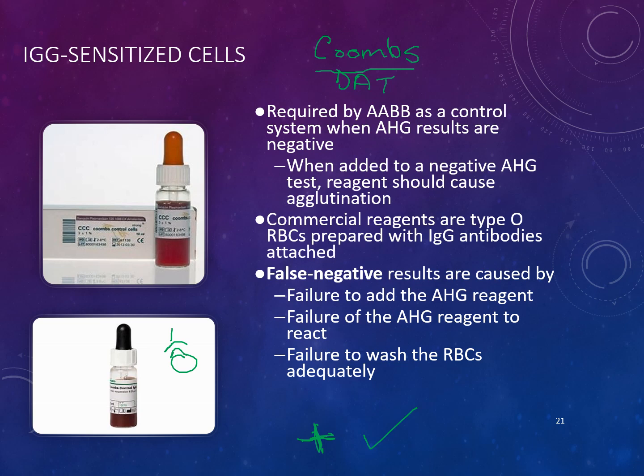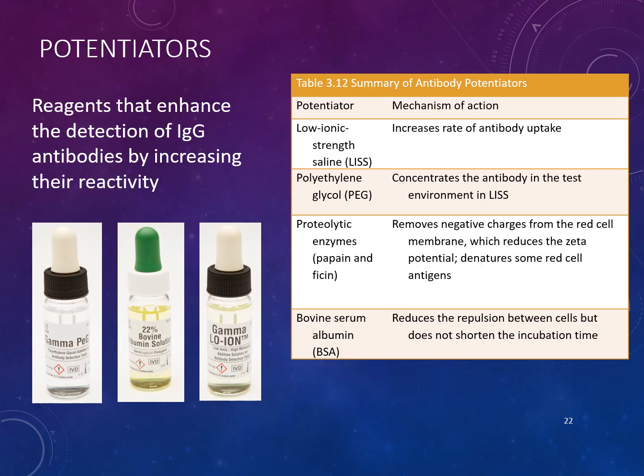But if you hear someone refer to a Coombs test, they're just talking about that DAT test, because the test was named after the inventor, whoever came up with that test. Now, when we start learning about the different antigens and antibodies that a patient could potentially have, we're going to start learning that they each have a different mode of operation. That has to do with their reactivity, how they respond in a sample, how those antibodies interact with those antigens when they're presented in there.